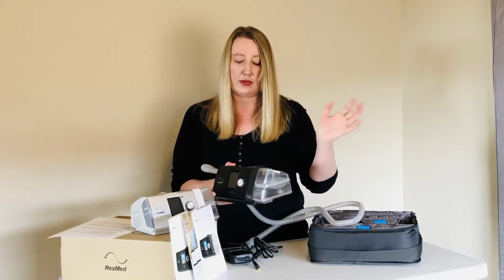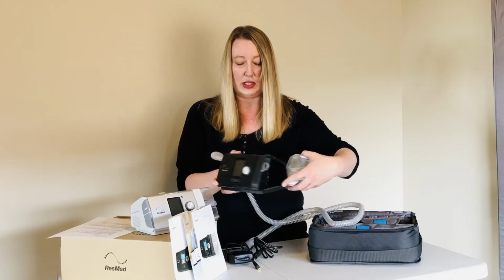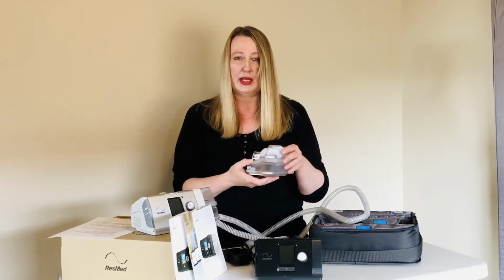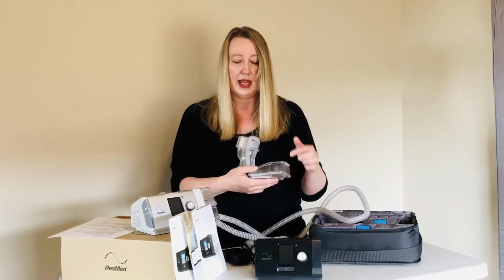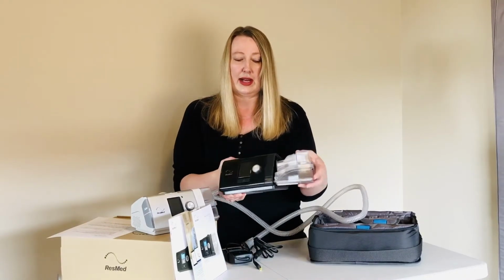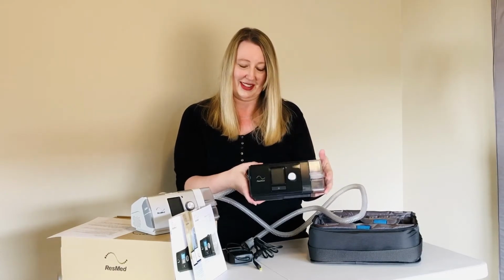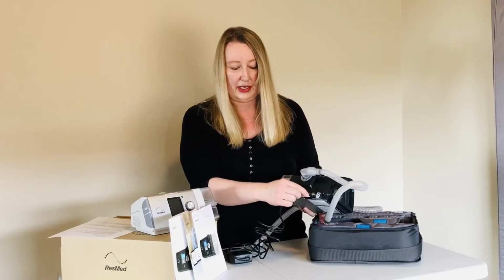To remove the reservoir, press and pull at the same time. You will notice the heat plate generates heat and transfers heat to the water chamber, becoming a heated humidifier. There are two tabs, pull to open and fill to the max fill line with distilled water only. The water reservoir must be in the unit correctly for the machine to function, and you never want to tip water into your unit. Your electrical source attaches right here.